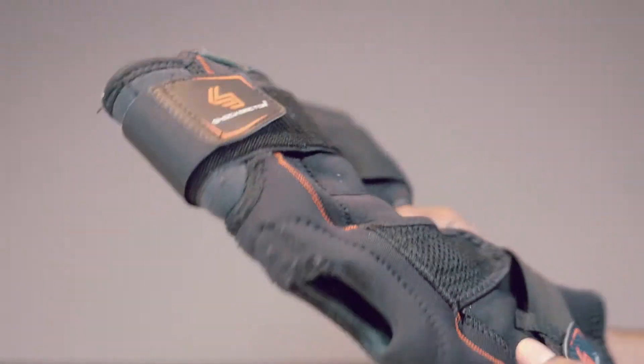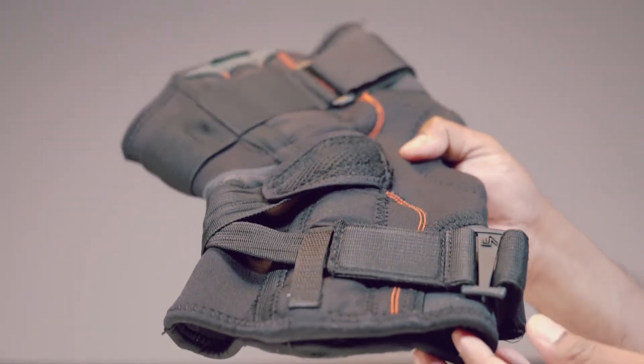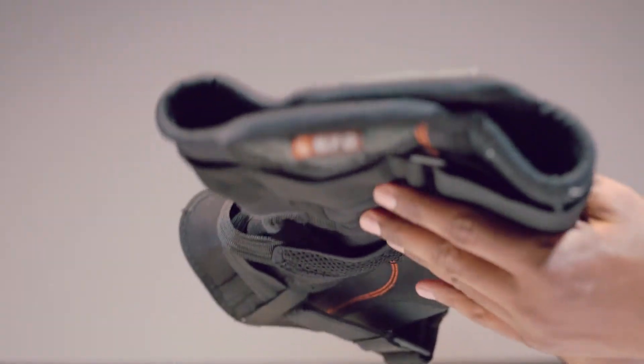Shock Doctor has different performance levels for their products. This ranges from 1 to 3. This is considered as performance level 2 support.